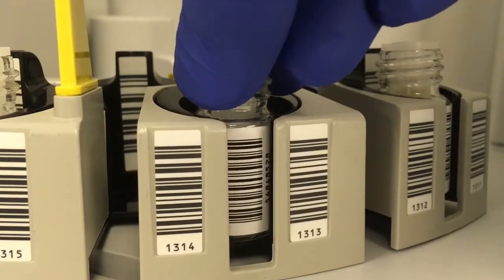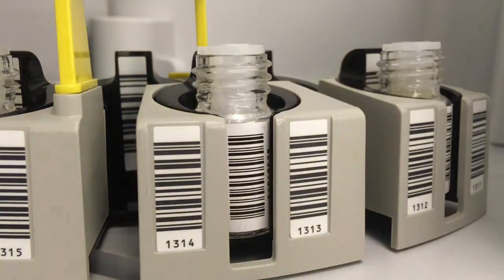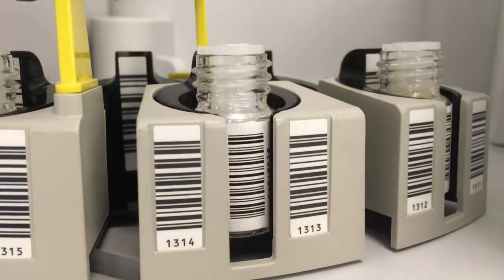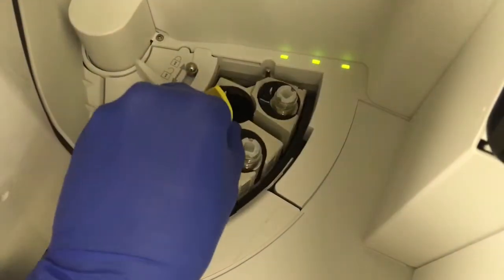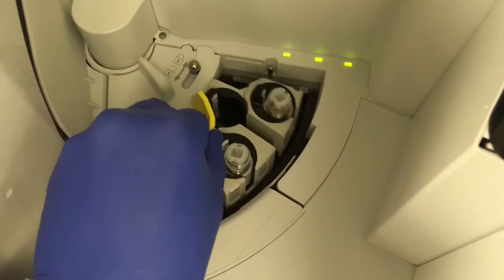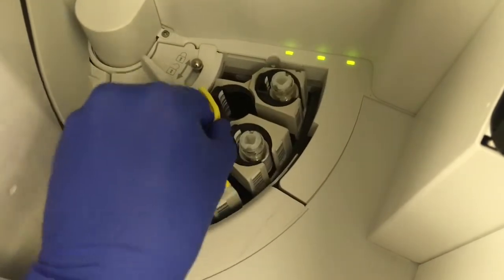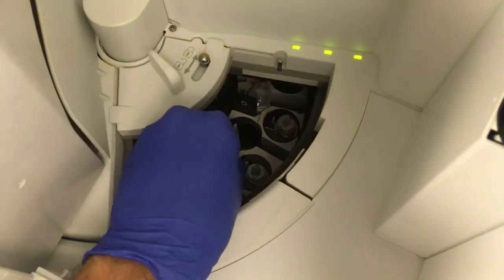You can see this snugly fits in there. There are different sized bottles depending on the reagent, and the racks will have a variety of sizes as well, so you just have to make sure you put them in the right spot.